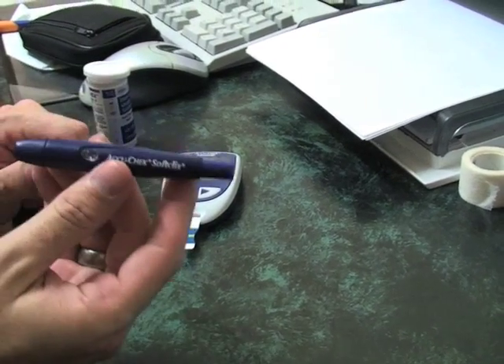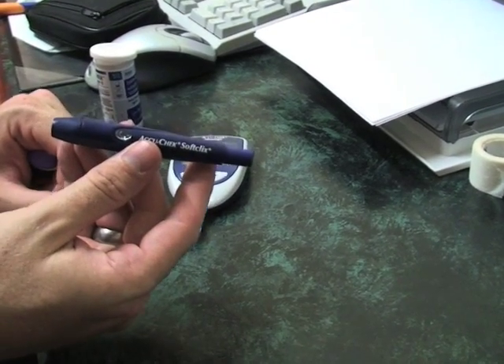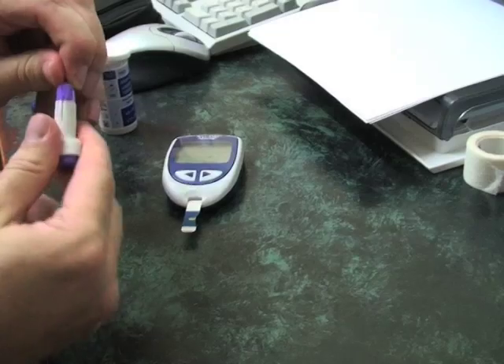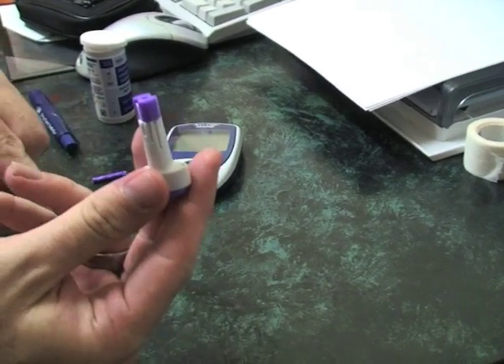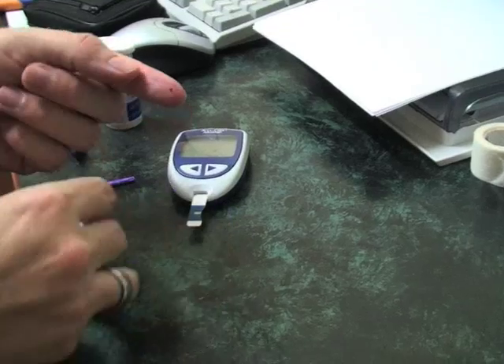You can either use one of these devices, which are very common. However, given that I'm in a medical center and we have lots of different patients, we use the individual ones, which are like these. Basically, all you do is get the prick up, pop it on your finger, push it against the finger, and hit the button.